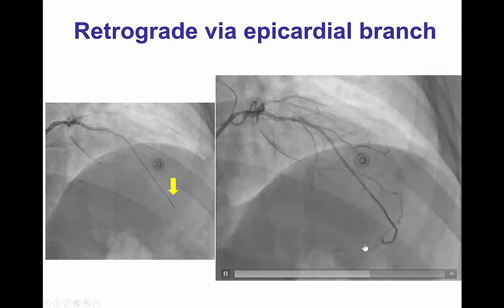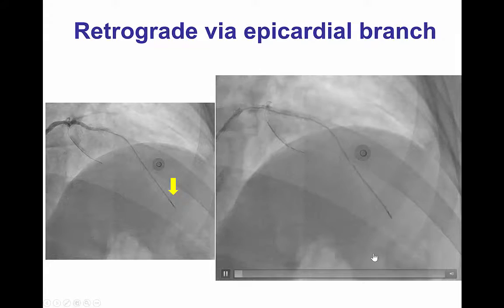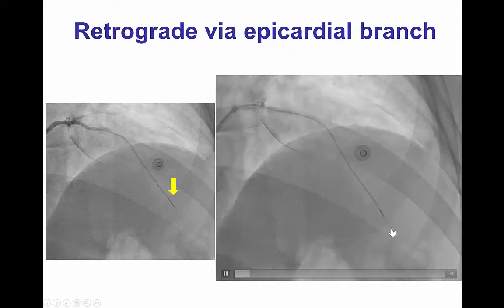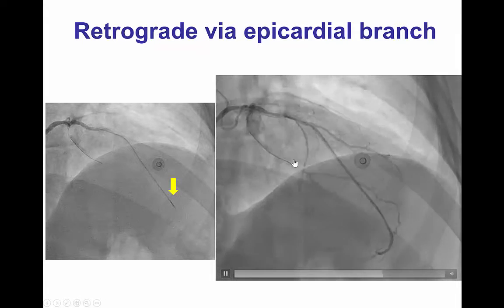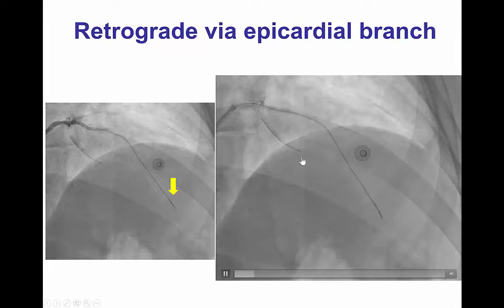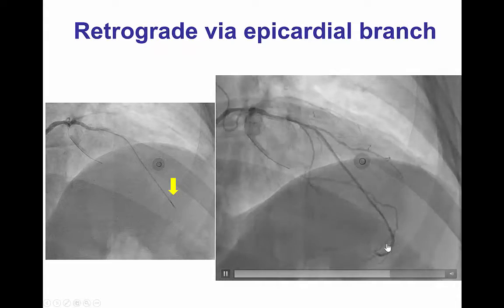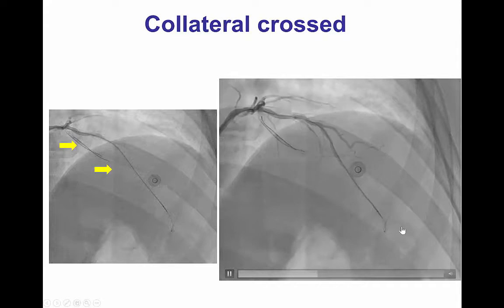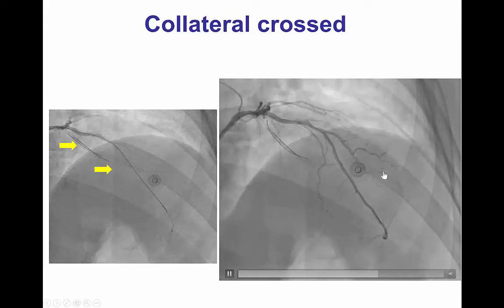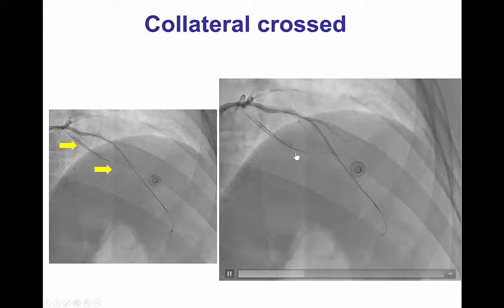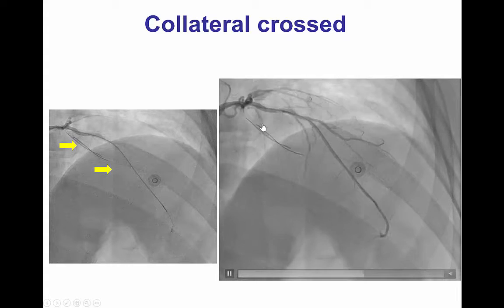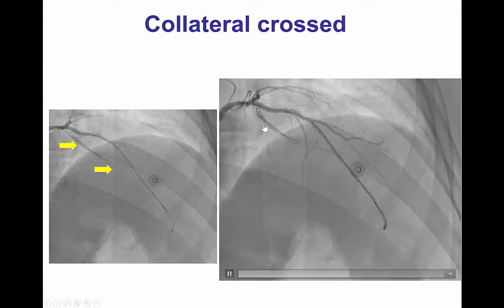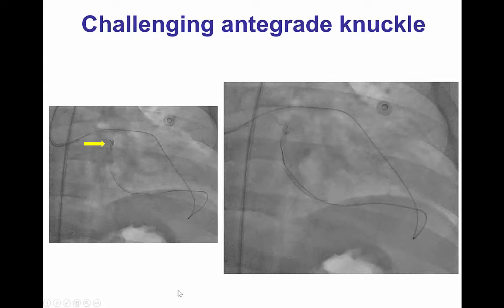We then noticed that the patient had a large epicardial collateral coming from the distal LAD all the way to the second obtuse marginal, and we were able to wire through this collateral using a CN wire all the way into the true lumen. We can now see that the retrograde wire is in a different plane than the antegrade subintimal guidewire.